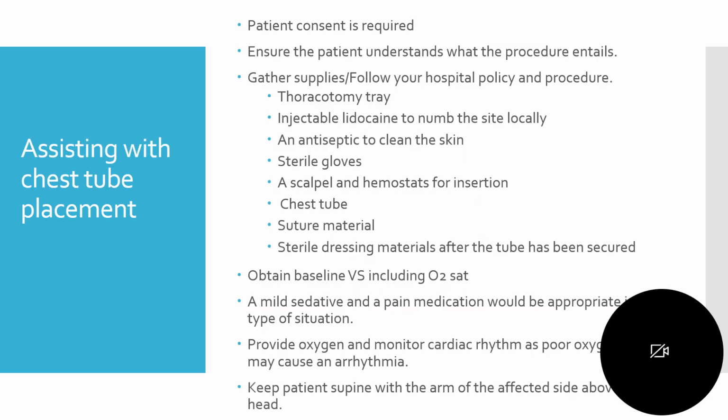Chest tubes can be inserted in the emergency room. They can be inserted during surgery, and they can also be inserted at the bedside. So as nurses, it's our responsibility to know where things are so that if your patient is going to be having a chest tube, you know where to find the items that are needed for this procedure.